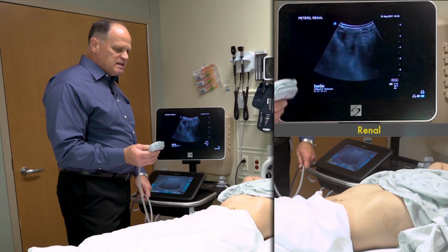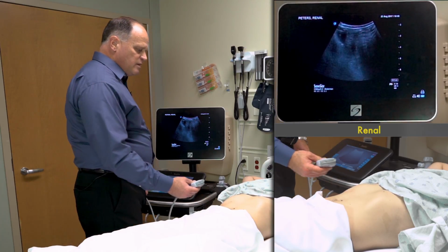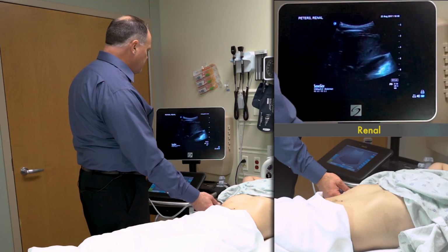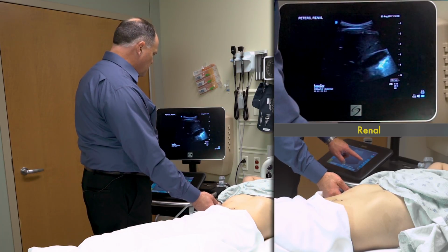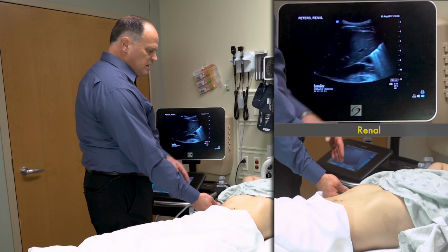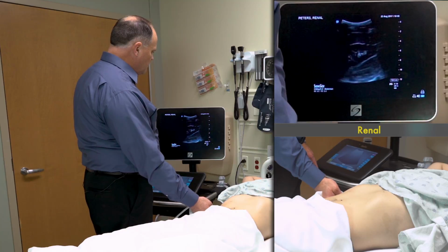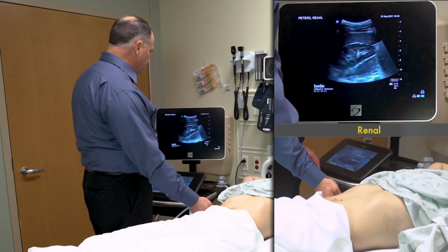So when I perform this exam, I use the curvilinear probe. I approach this the same way as I would the FAST exam, which is using the liver as the acoustic window. Get plenty of gel, and the first thing I do is find the liver and then adjust my depth settings. I realize in the coronal plane I may not see the kidney because I'm directing the beam straight across his body, and knowing that the kidney's in the retroperitoneal space, I aim the probe posterior, and the kidney usually comes into view pretty easily.